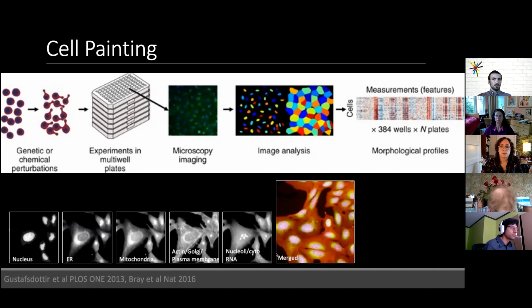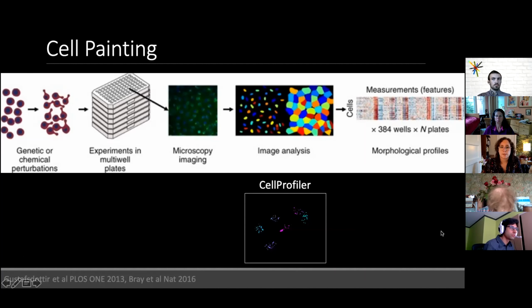So one tool in this image analysis toolbox is Cell Profiler, which I use a lot in my research to really good effect. And it's free software produced by the same group at the Broad Institute. And it has really broad applicability for processing large data sets of cytological images, which can be used to identify mechanistically relevant features of cells. So like within these nuclei that were automatically segmented by Cell Profiler, you can appreciate the nucleoli or clusters of RNA in the cells.